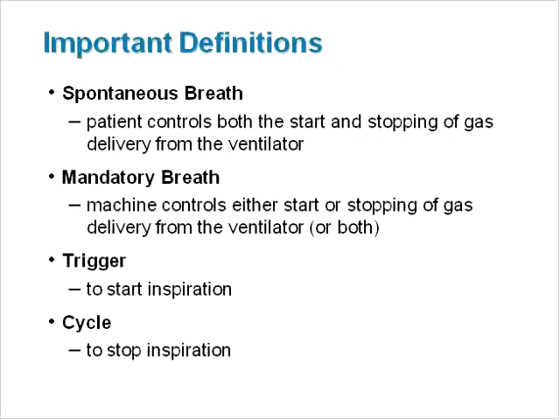In addition, we need to agree on some basic terms of mechanical ventilation. The most basic terms are spontaneous and mandatory breaths. We use these terms all the time, but seldom give them explicit definitions. However, when describing modes of ventilation, we need to be more specific. Therefore, we will define a spontaneous breath as one for which the patient has control over the timing. More specifically, this means the patient controls the inspiratory time and expiratory time, or equivalently, the frequency and IE ratio. Note that this definition does not imply connection to a ventilator.